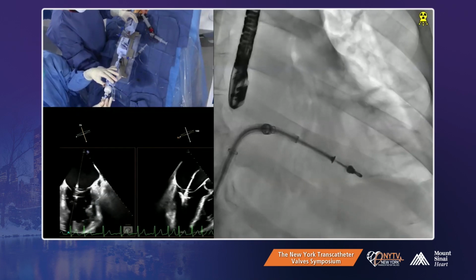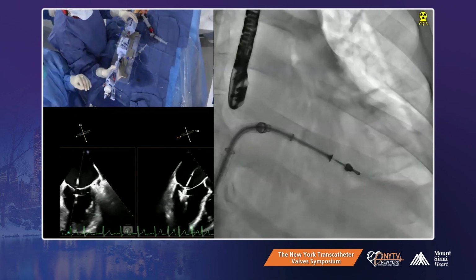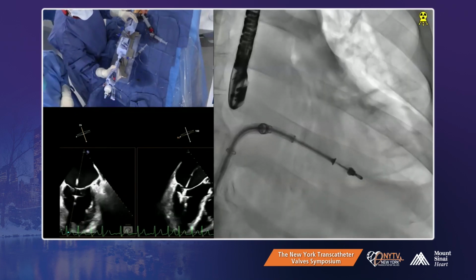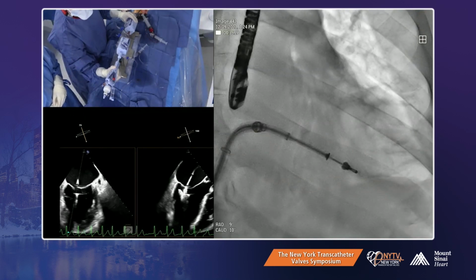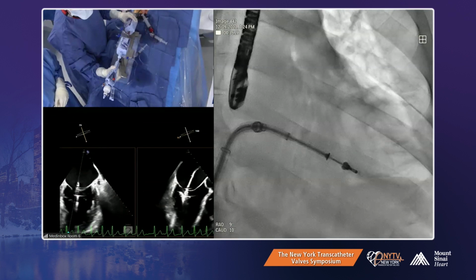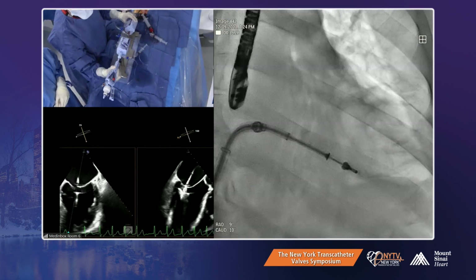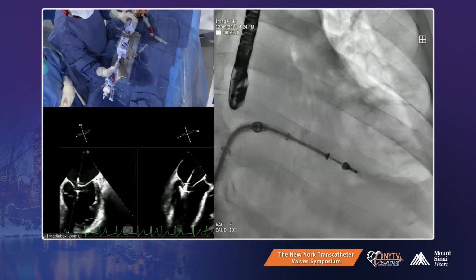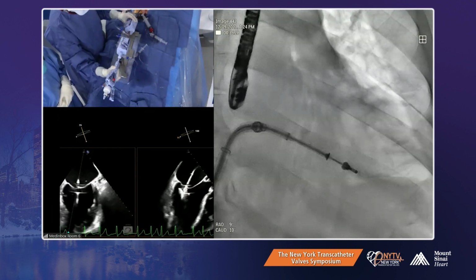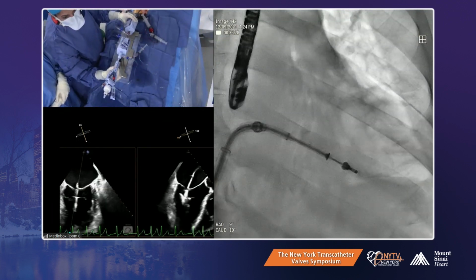You may have to get it separate, right? We can. Oh, your posterior is caught, it's buckling. So go down a little bit and free the posterior leaflet. You got to free the posterior leaflet. Yeah, now it's okay.